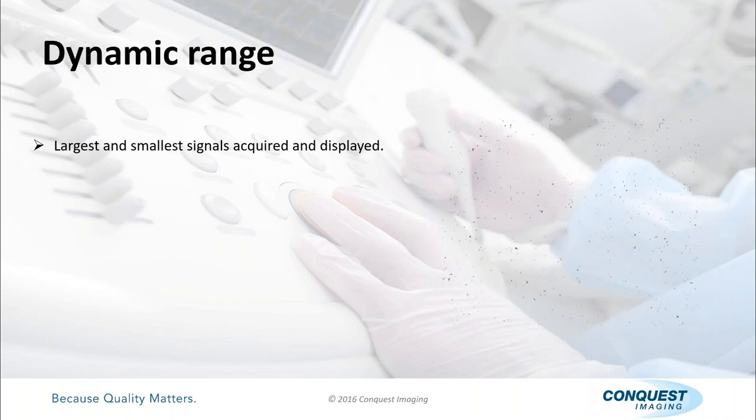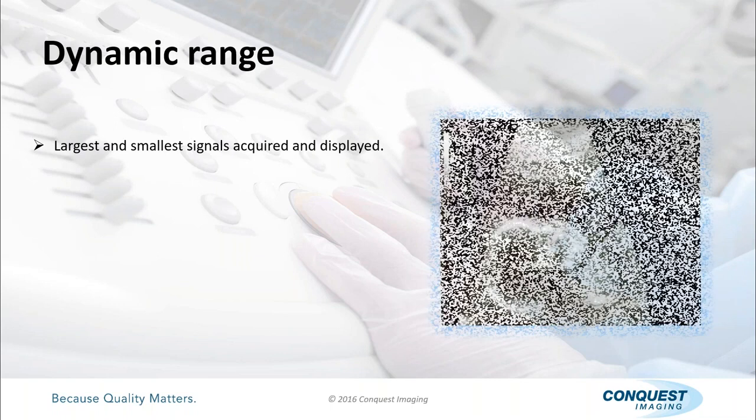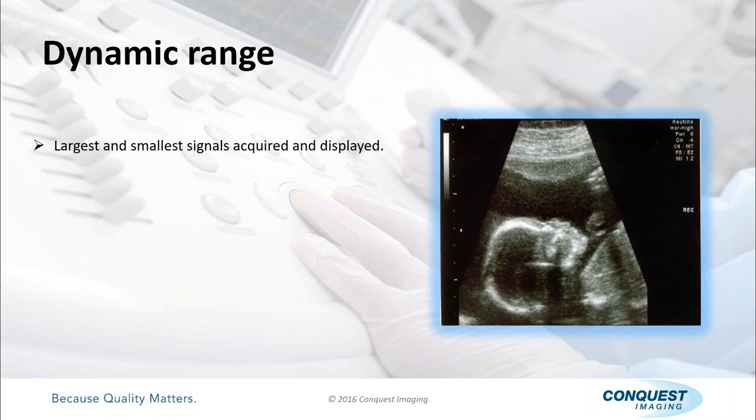Dynamic range: the largest and smallest signals acquired. I've already kind of described that. We have the least dense versus the most dense. So right here, you have your amniotic fluid, which is going to give you very, very little reflection, very little echo. And clearly we have bone, the jaw, which is why you get this dark spot underneath, because of the density of the jaw. Okay, so not much else we can say about that. We just have very specific limits, and we don't do well with air. There's no echo from air, right?